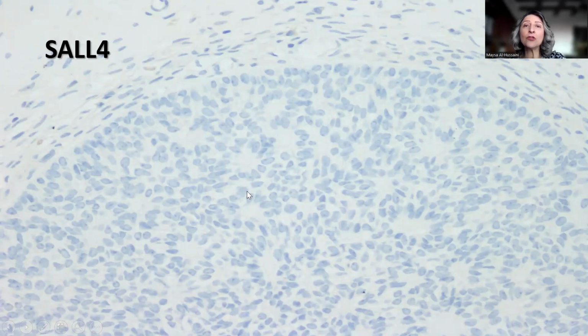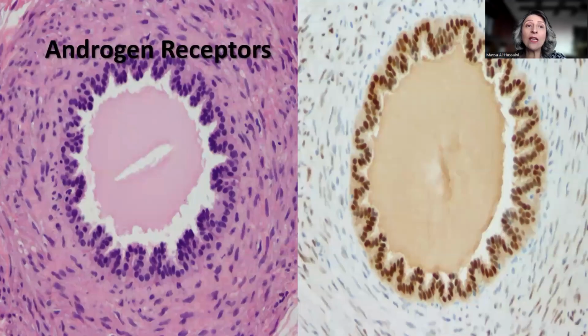completely negative. And remember, the patient received chemotherapy on the assumption that the patient had dysgerminoma, for which the dysgerminoma component showed complete pathological response around those gonadoblastoma formations, as well as within the gonadoblastoma formations, leaving those stromal cells as evidence for the original diagnosis.